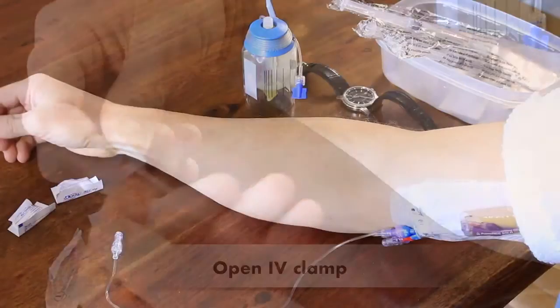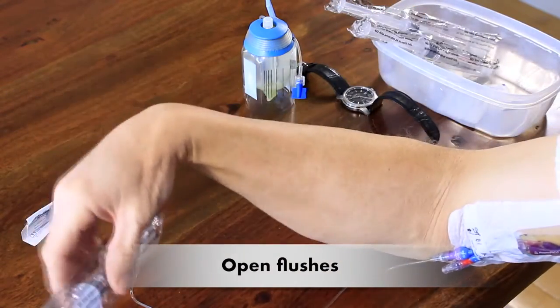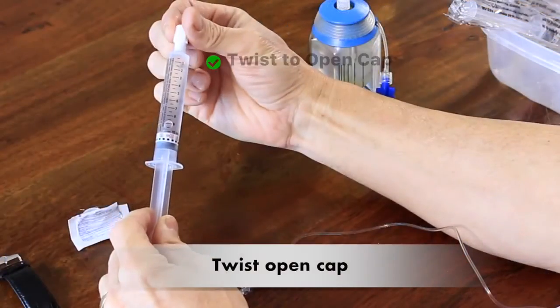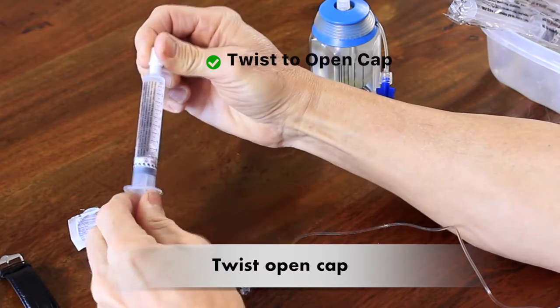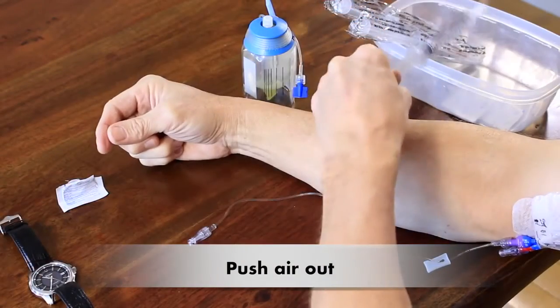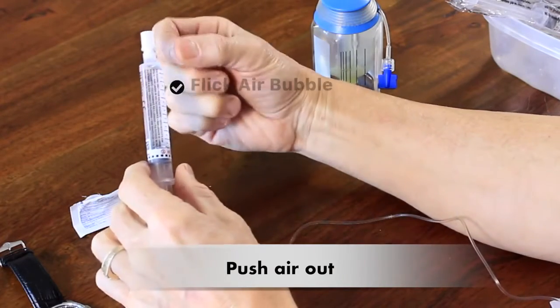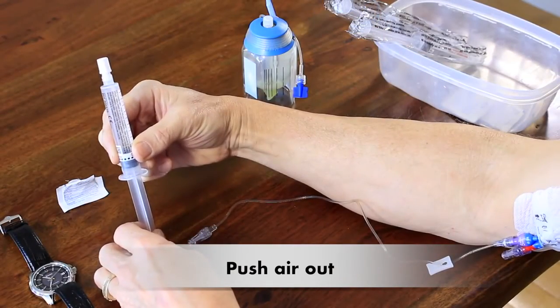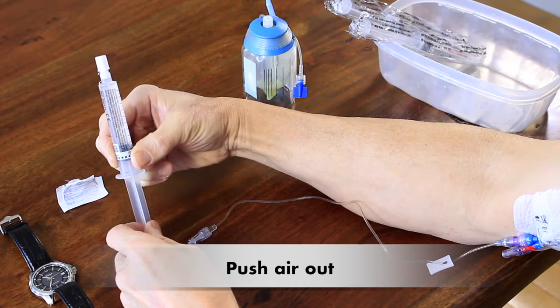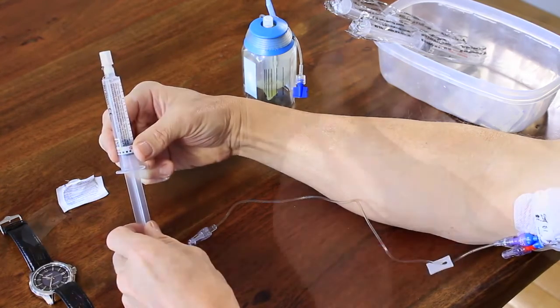Now you need to open the wrapper of the flush, and you need to remove any air in the flush. So loosen the cap, just twist it a little counterclockwise, just one turn, but leave the cap on and hold it upwards. Now there's a little air bubble in there, so he's tapping it on a container just to loosen the air bubble. You can also flick your finger to move the air bubble off the wall of the flush. Now you can pull the plunger down just a little bit and then push the plunger up so that pushes any air out of the flush until you see just a few drops come out of the top of the flush.